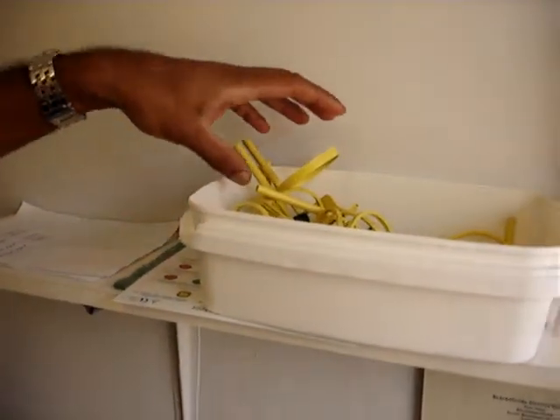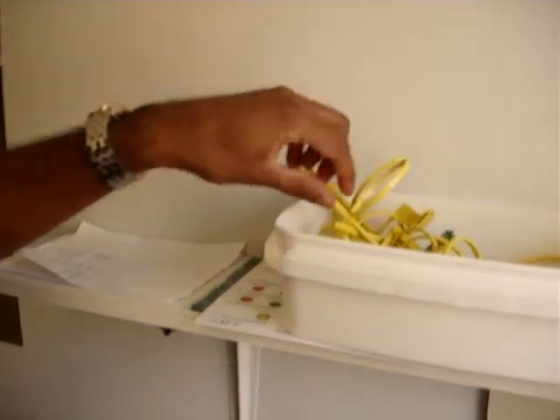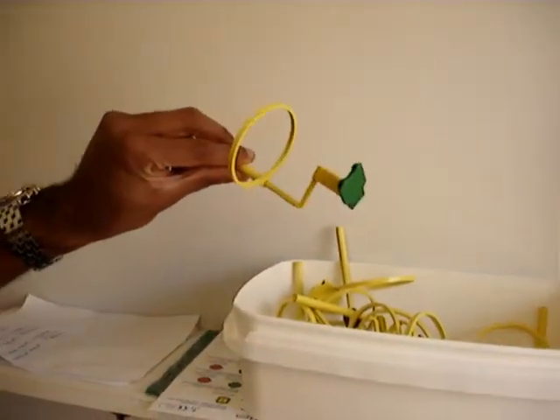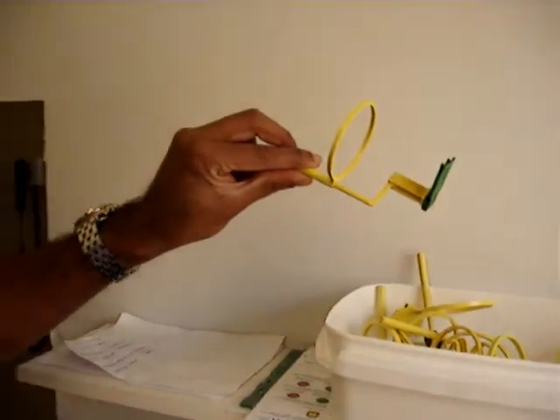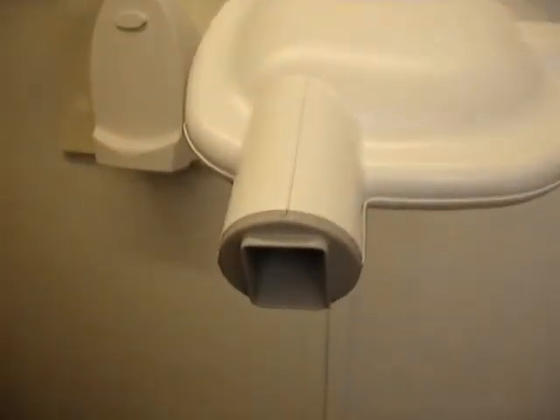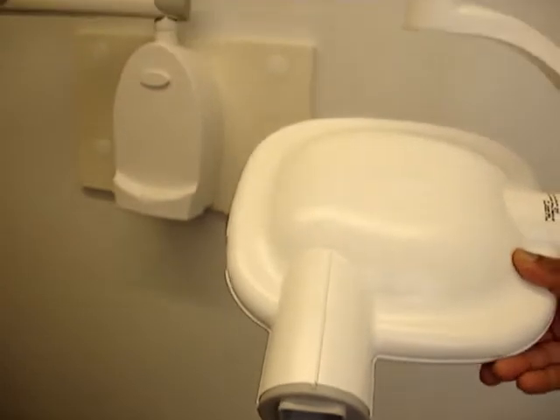And behind here I can see some little holders. These are for your regular intraoral x-rays — the ones that go in the mouth. The smaller x-rays in the mouth have aligning devices so you can get absolutely bang on. It's like a little target — that circular bit — and it fits on the end there so it's easy to line it up and get the right bit in the picture.